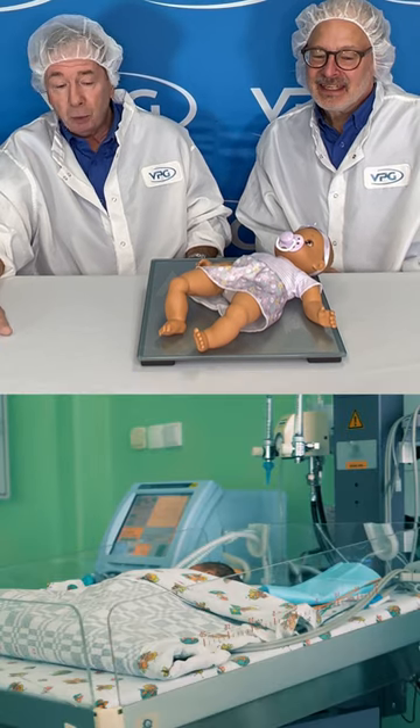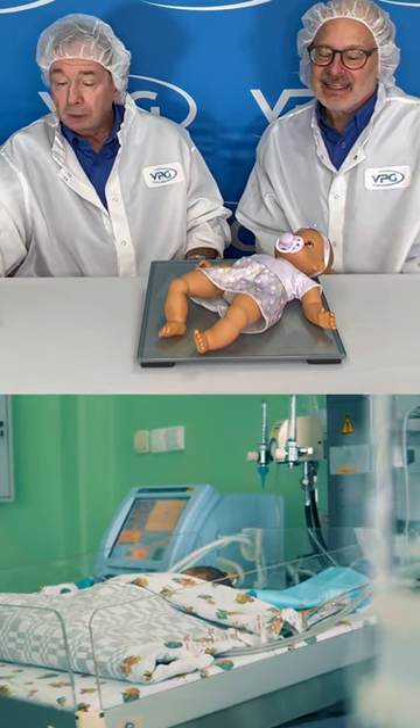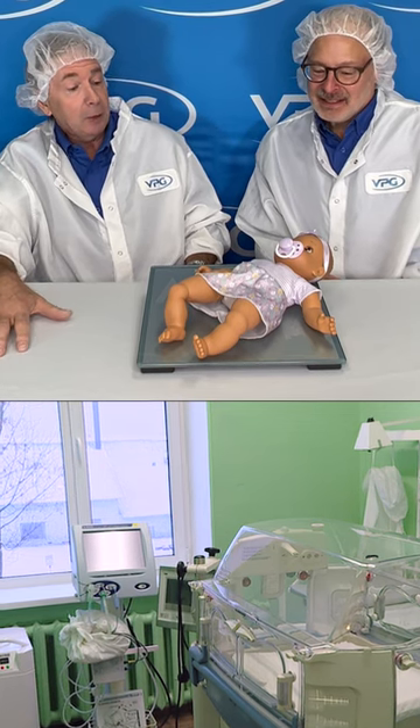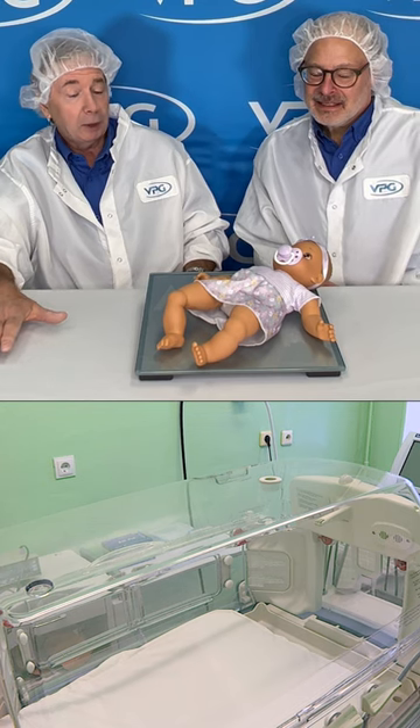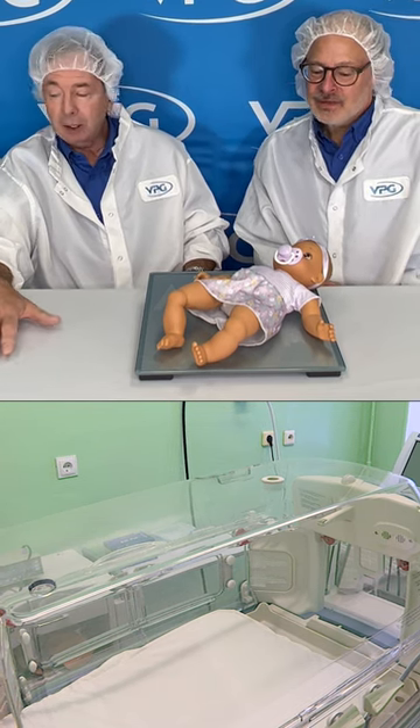So primarily, we have an infant system that weighs an infant in the crib — you don't have to take the baby out, just wait on the spot and get a live reading. We also have incubators.